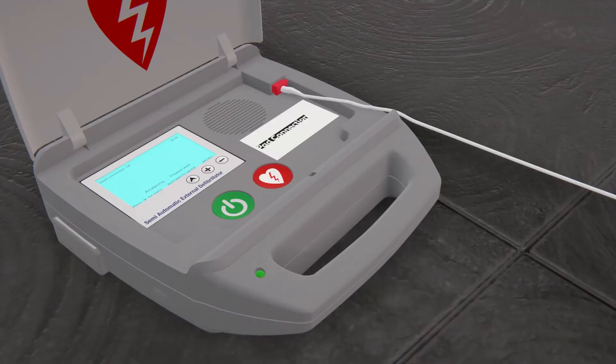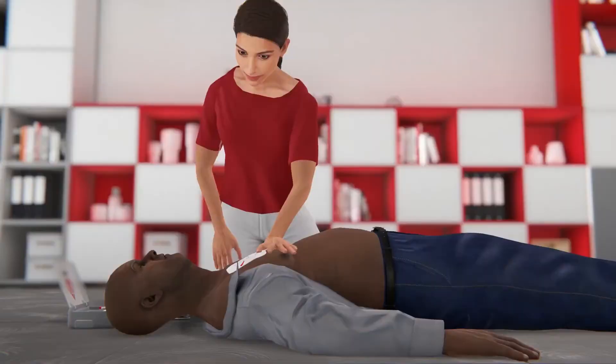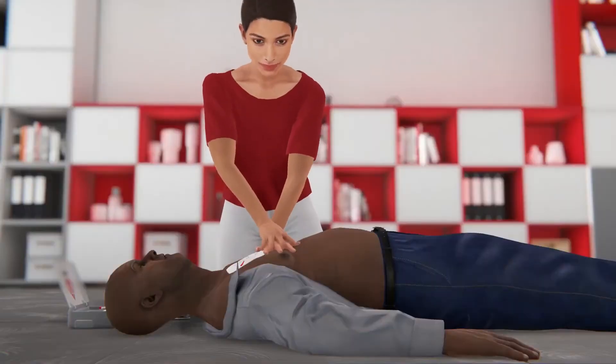The AED will analyze the heart rhythm. If the AED tells you that a shock is not needed, resume hands-only CPR.